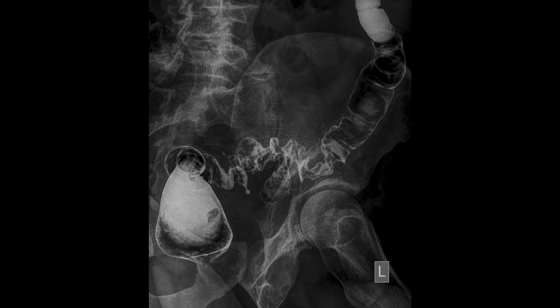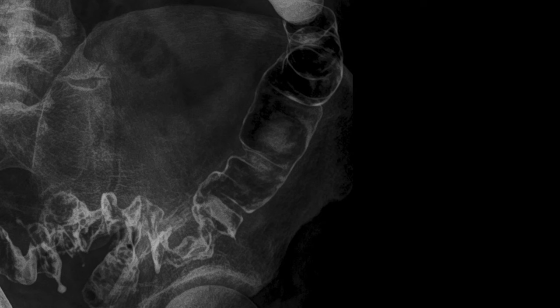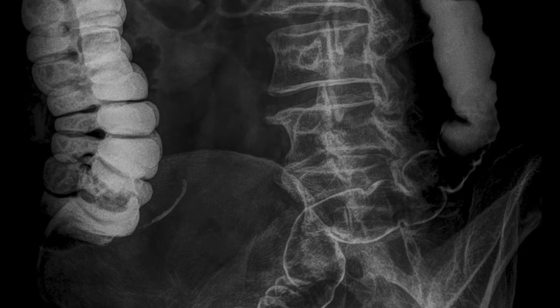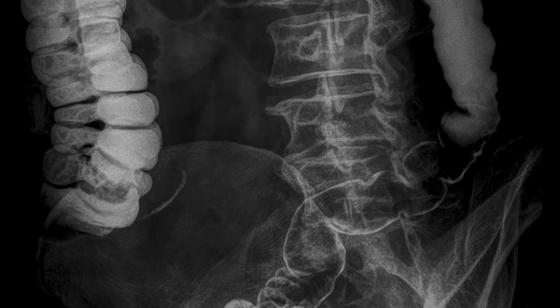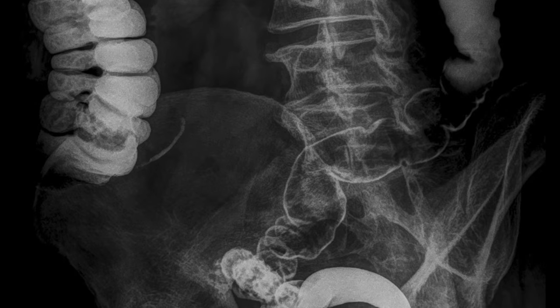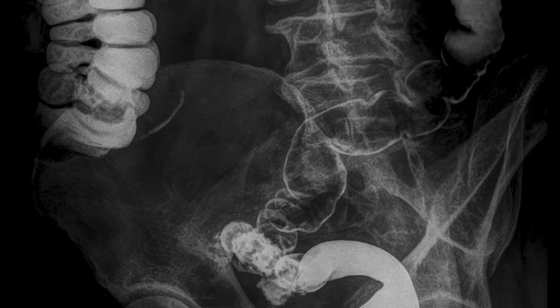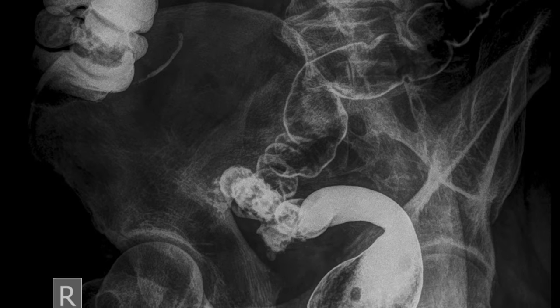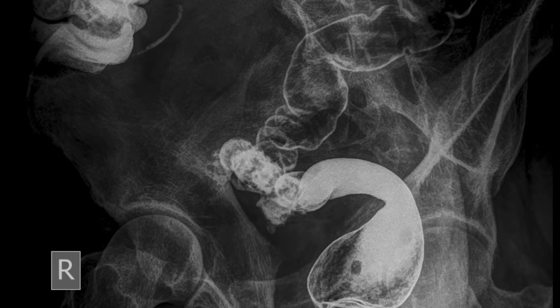The patient should be told to keep the air in and not release it, and then quickly start taking pictures. Look at the colon on IITV for narrowing, strictures, polyps, and diverticuli. Concentrate on those areas and use compression images to get a complete study. After viewing the entire set of images, ask the patient to pass out whatever barium remains inside, and take a post-evacuation film. That ends the barium study.